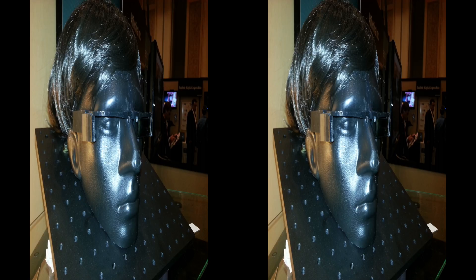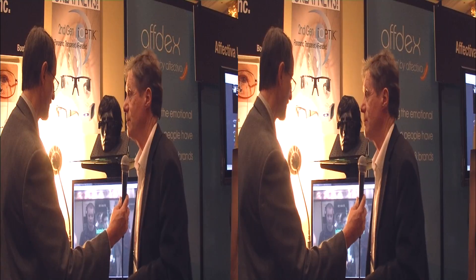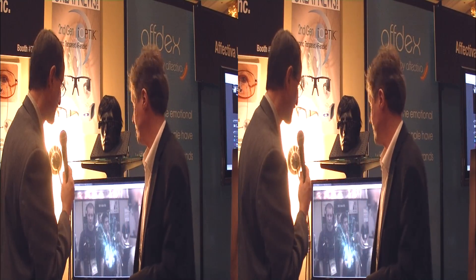The imagery is not great because of the lighting conditions at the show, but this is full 720p in the products we're building and prototyping — full 720p, full color, all the attributes you'd expect, and fully transparent. It's kind of amazing that you can do this, and here's the superimposed media right here in the middle of your field of view.